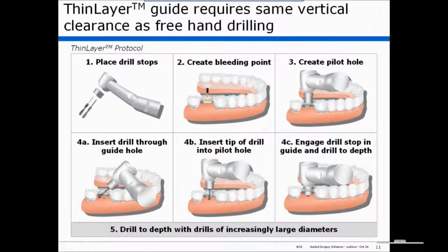The Thin Layer Guide addresses these issues by its design. First, we provide a snug-fitting, disposable drill stop. And these are made custom for any drill system that might be used.